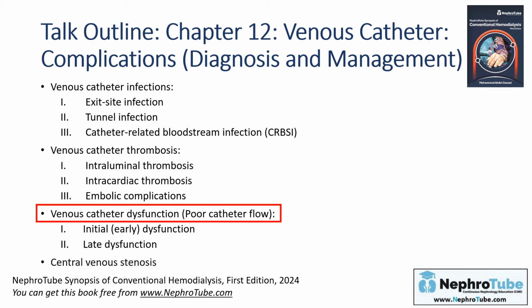And now we will cover venous catheter dysfunction, poor catheter flow. What is meant by venous catheter dysfunction or poor catheter flow? This means that there is a failure to maintain blood flow during hemodialysis, which is adequate for hemodialysis without lengthening the dialysis treatment time.